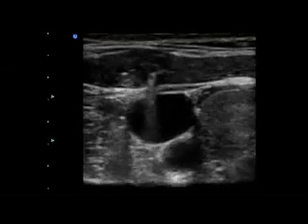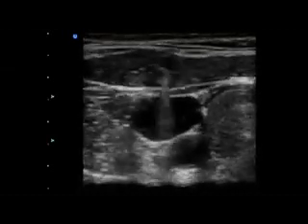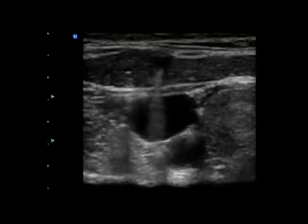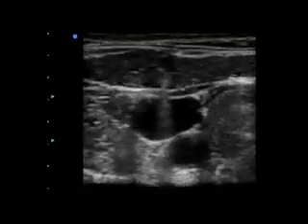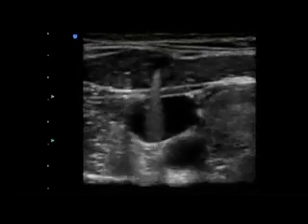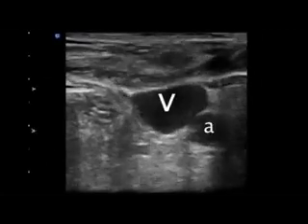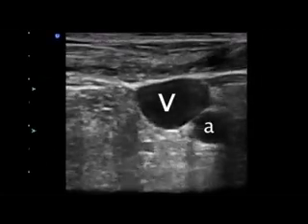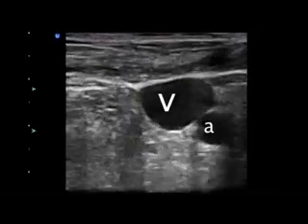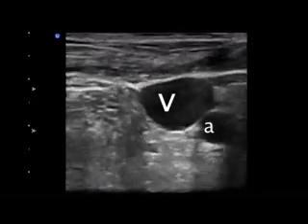It may be possible to see tenting of the anterior wall or complete collapse of the vein when the tip of the needle presses against it. A quick forward movement of the needle at this point may help to puncture the vessel wall. The return of blood confirms intravascular placement of the needle tip. The main benefit of the transverse approach is that it allows simultaneous visualization of both the artery and vein. This allows the operator to advance the needle toward the vein with almost no danger of hitting the artery.